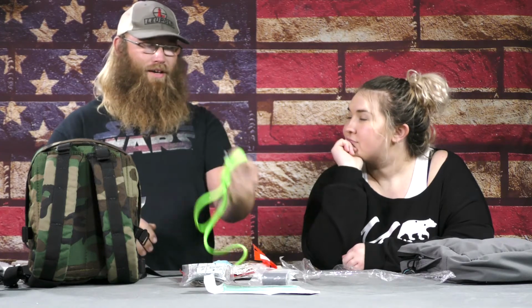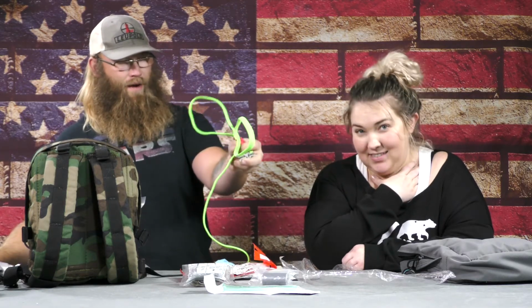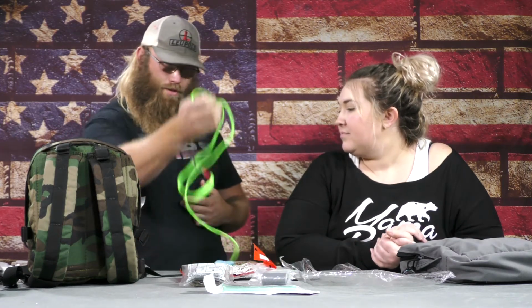But yeah, they work. I know y'all have mentioned that these tend to work best in force on force scenarios during the fight. I watched that recently too, where a guy is trying to put on a CAT tourniquet. I like them. I like them a lot. I like the Recons better. Wish they could still make them. But with a small redesign, you can just get it unraveled, wrap it up, no big deal. You really only need 2 wraps to stop the blood flow. The rest is just kind of extra.